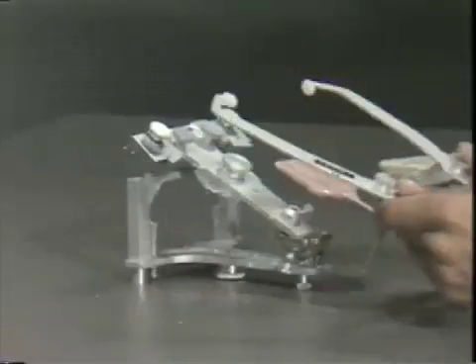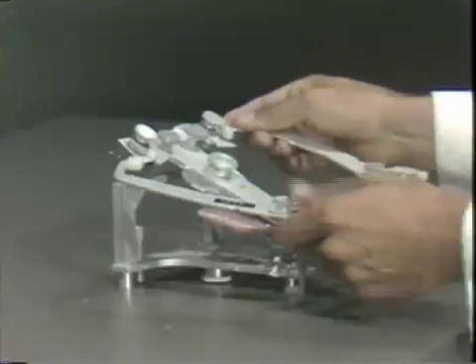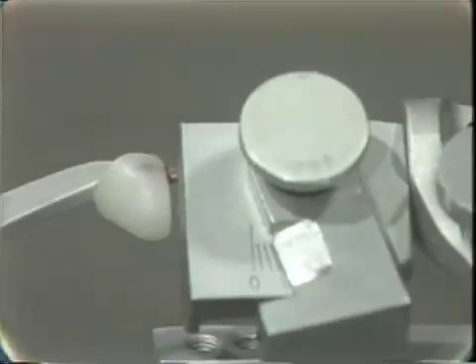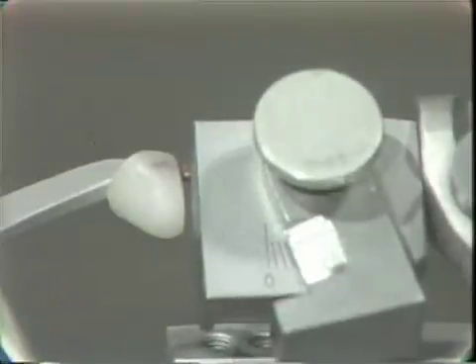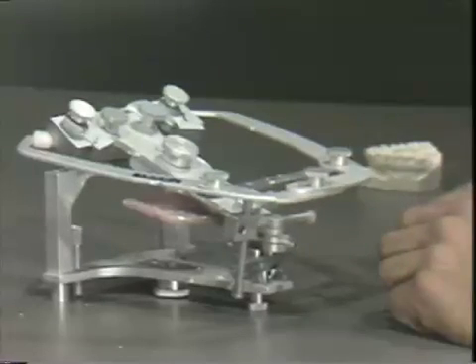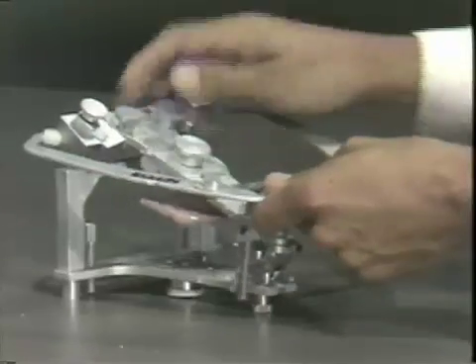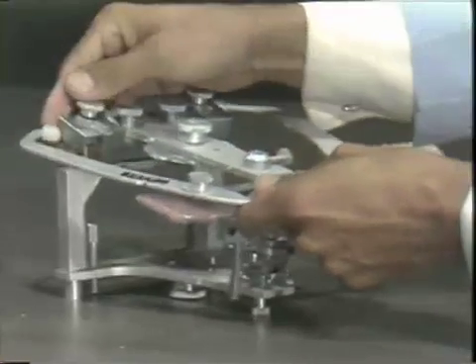You can just let the articulator rest, slip the bite fork on, open the articulator, and there are small openings that go onto the little prongs on the side of the WipMix facebow, and then this is tightened. This is an automatic centering mechanism. One problem I've demonstrated here is that I've locked the upper member inside — the upper member actually belongs resting on top of the facebow, which is your third point of reference.